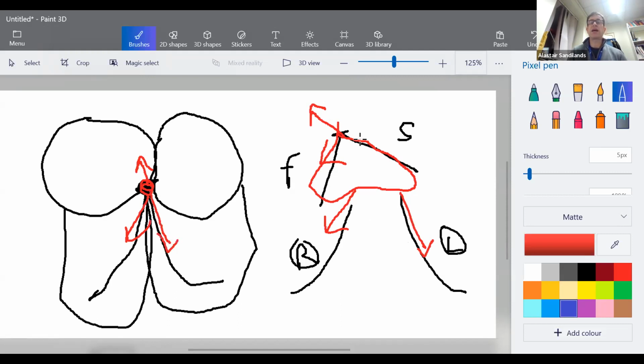And so what you see is you get simultaneous atrial and ventricular activation at the same time. So it goes atrium and the ventricles at exactly the same time. So invariably, you have a tachycardia and you really don't see any P waves. It's just QRSs that are the same height. I'm not drawing it very well, actually. I need to show you the ECG examples.